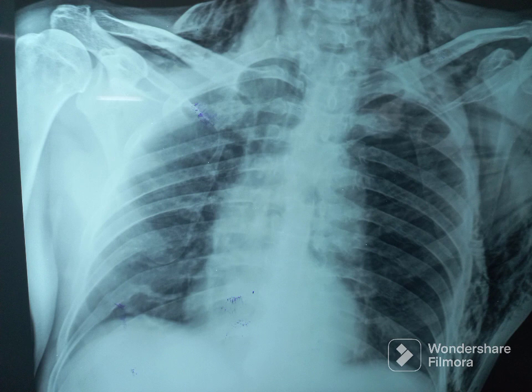Though obvious pneumothorax is not visible on this chest X-ray, CT scan revealed underlying pneumothorax in this patient. Considering all these findings, the final impression is subcutaneous emphysema secondary to trauma.